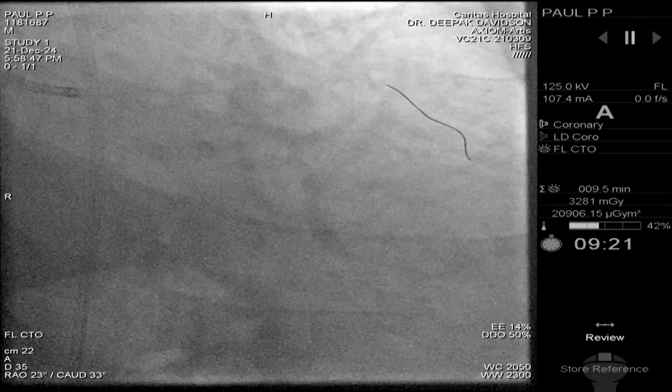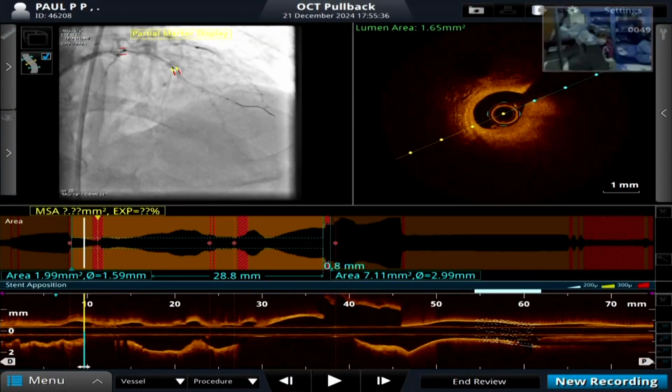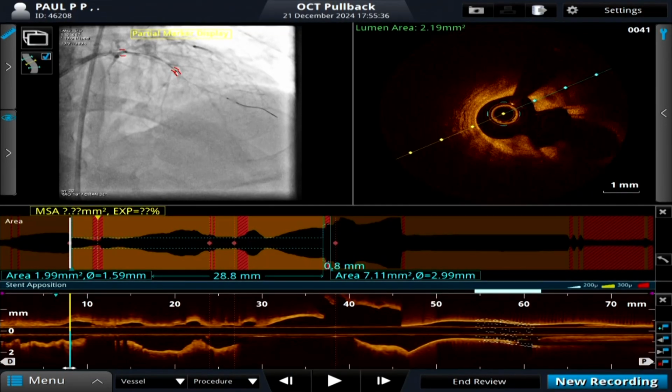Jojo, show the 28 is enough. 33 open chedo. Did you open it up?